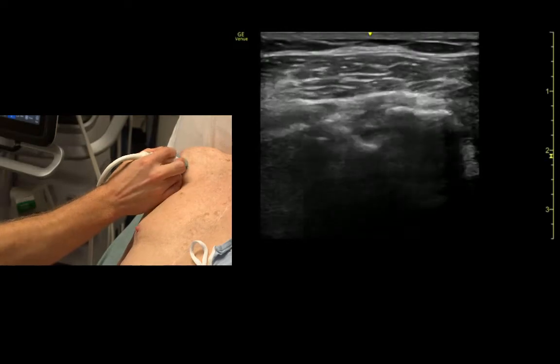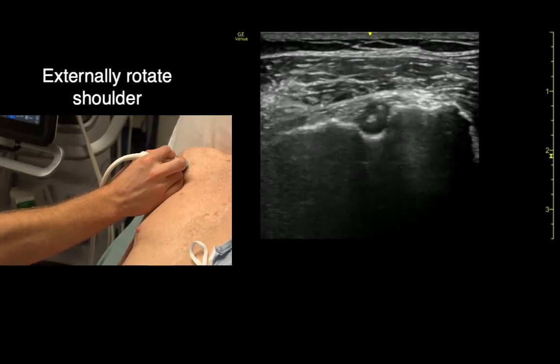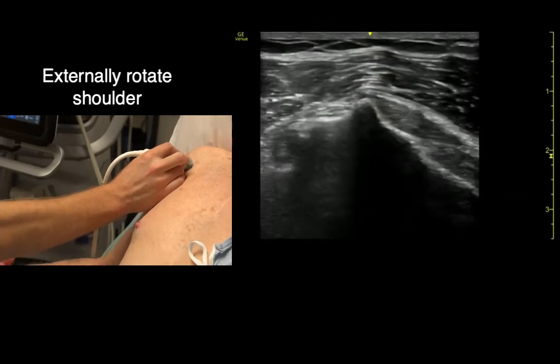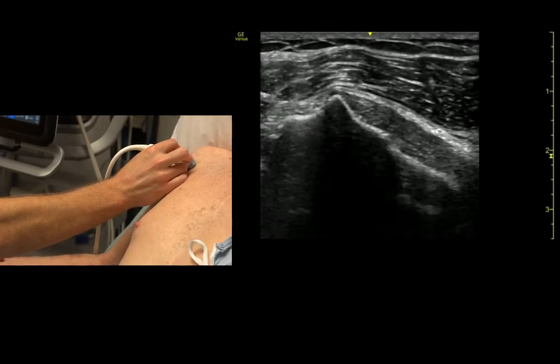If we come back to short axis and then ask Don to externally rotate, we can identify the subscapularis tendon running over top of the lesser tuberosity.